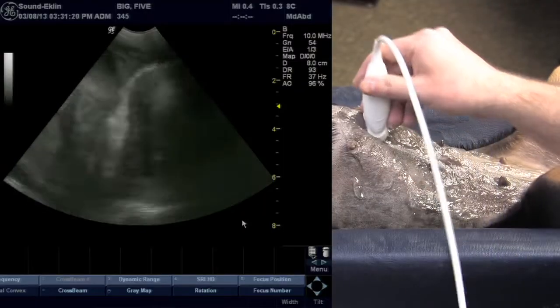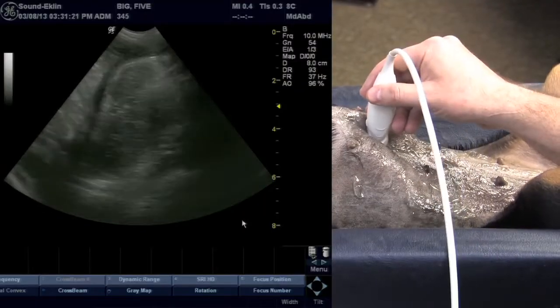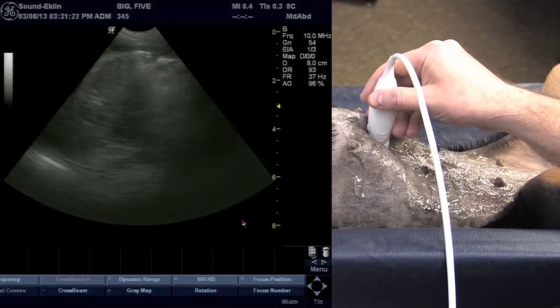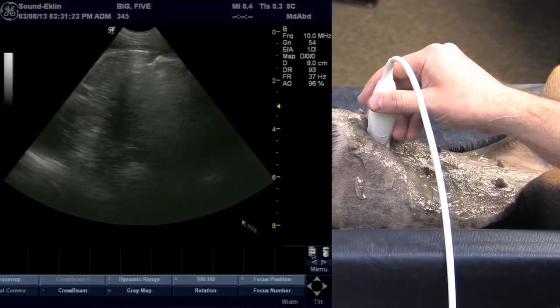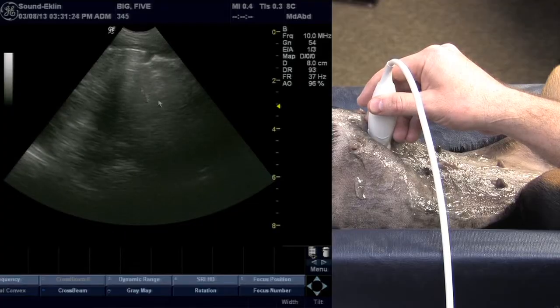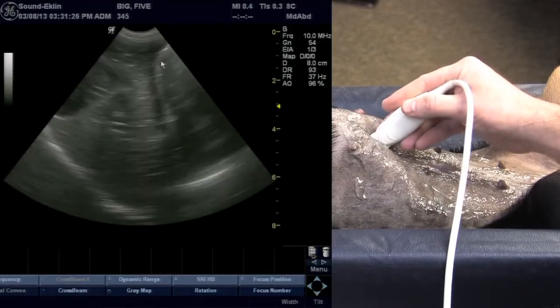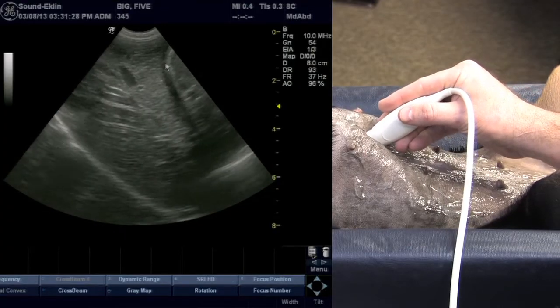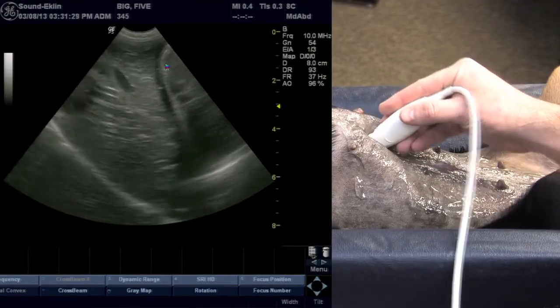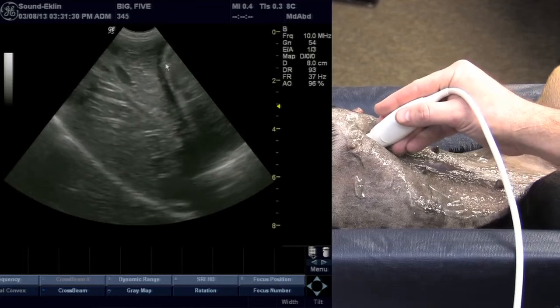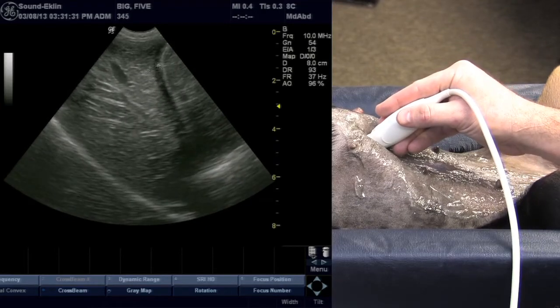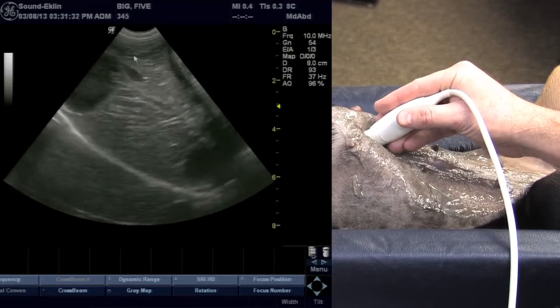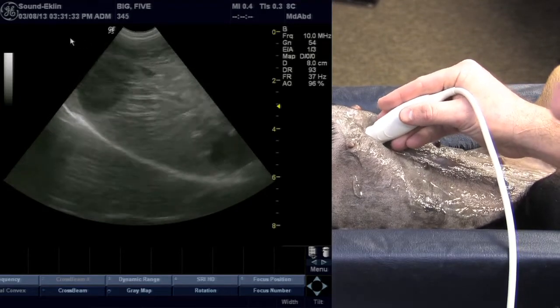If my probe is perpendicular to the patient, I'm going to encounter stomach and not be able to see the liver. So if I angle cranially — which is dropping the tail of the probe down — that will allow me to angle underneath the ribs.